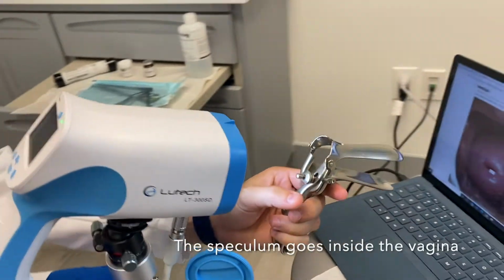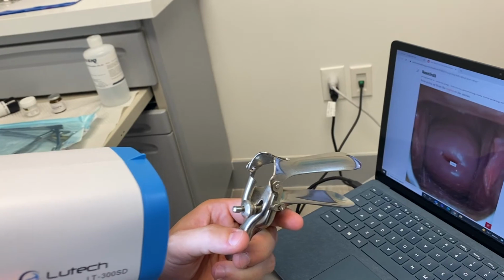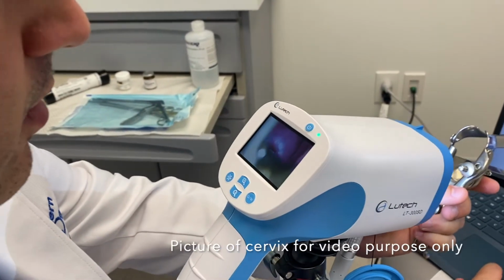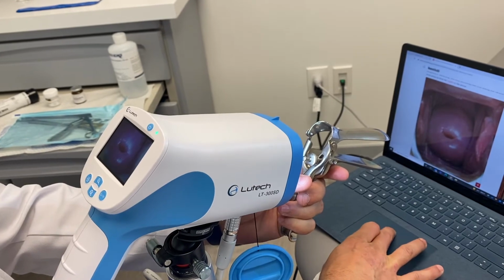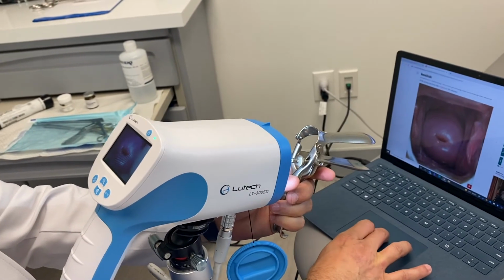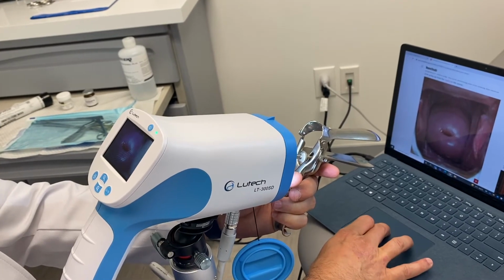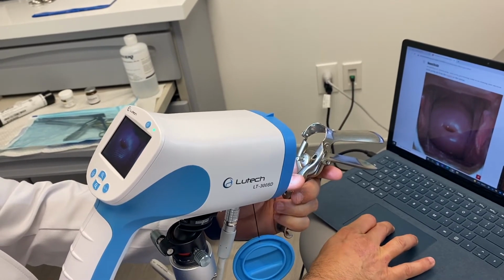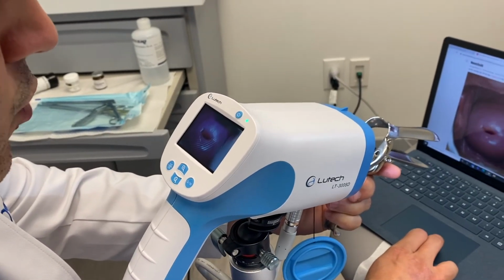We would insert the speculum, which would allow us to visualize the cervix. This here is a cervix. This is where we would take the biopsies from. This is called a transformation zone. The transformation zone is where we will usually visualize abnormal cells, and this is the majority of the pictures, and the majority of the biopsies will be done.